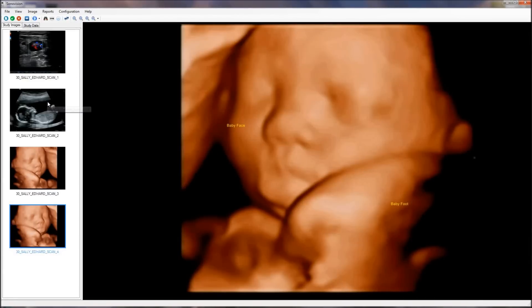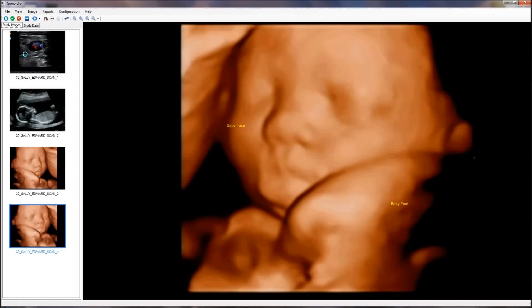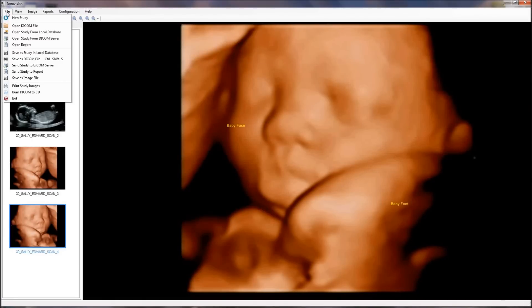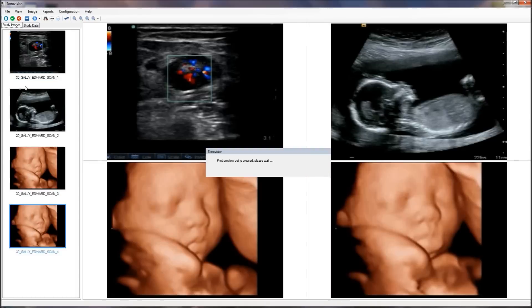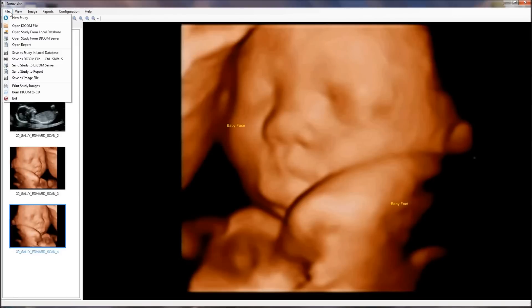Once you are done with all the changes in the study and images, you can save the study in the local database, or send the study to a DICOM server. You can also print study images through the computer printer, or burn the study data and images to a CD or DVD.